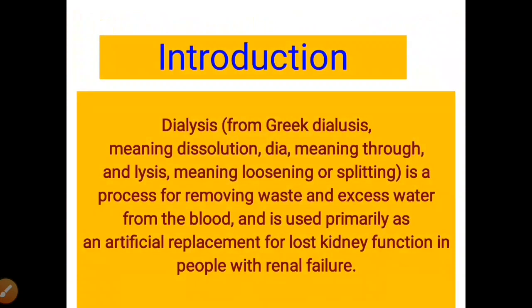Firstly, we should learn about the word dialysis. Actually, it's a combination of two Greek words, dia and lysis. Here dia means through and lysis means loosening or splitting.